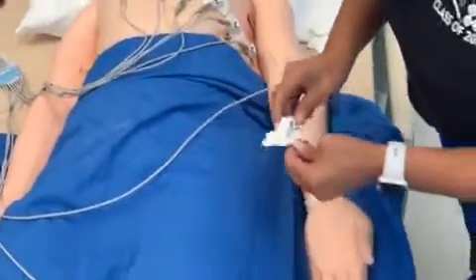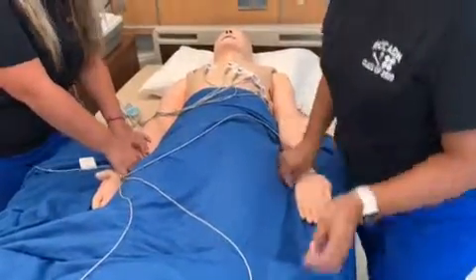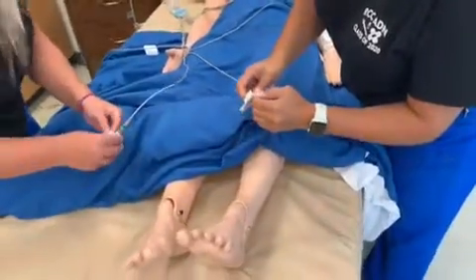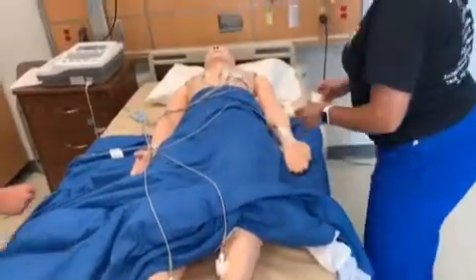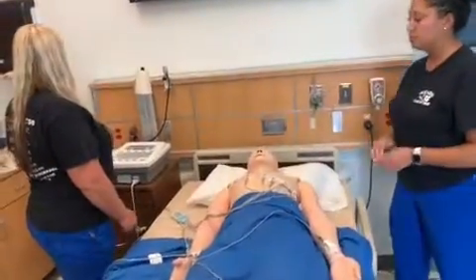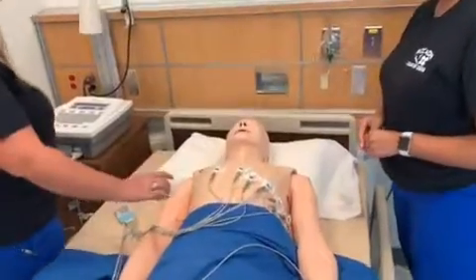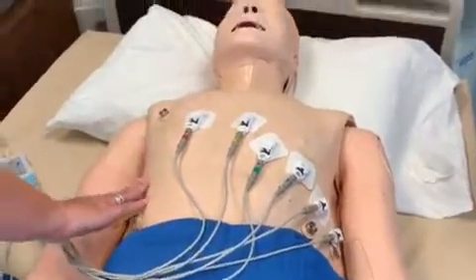And now we have the limbs. We're going to do left arm, right arm, right leg, left leg. And then there is also something called a right-sided 12-lead EKG, and it's just V3, 4, 5, and 6. It's just going to be mirrored to the right side.